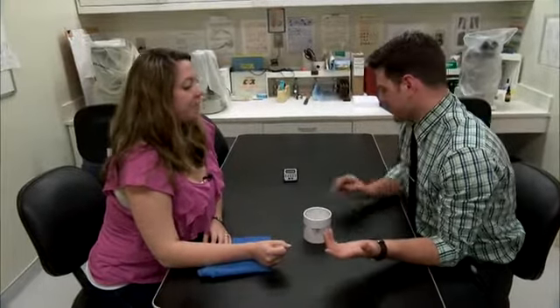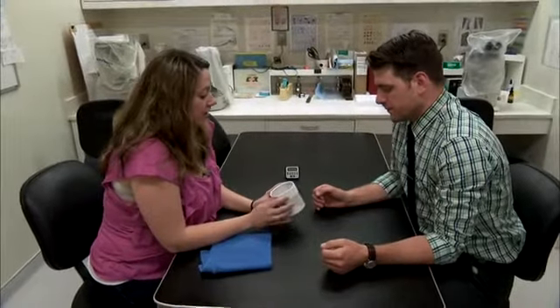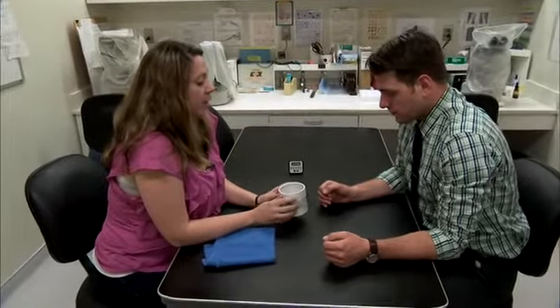My arm itches. Yes. Timer's done. What's the next step? So we know now that these are fed. We can see that. But we have to make sure that they're actually infected. To do that, we have to dissect out their salivary glands and see if there's parasites in there.